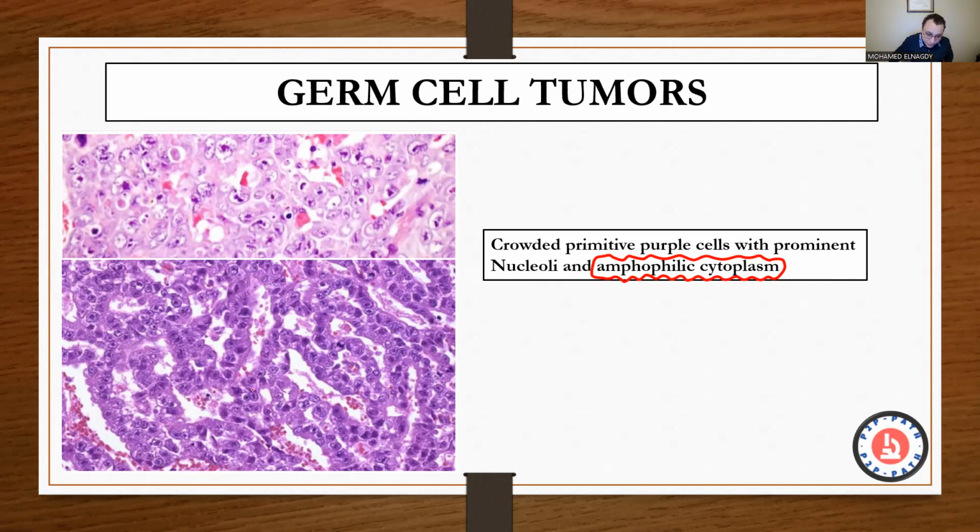And the nuclei, of course, show clear nuclear pleomorphism and clearly prominent nucleoli, as you see right there. Extreme nuclear pleomorphism, as you see. So you are dealing with embryonal carcinoma. So embryonal carcinoma: you have these columns, worm-like arrangement, pleomorphic cells, large nuclei, prominent nucleoli, amphophilic cytoplasm. Please remember, amphophilic is embryonal.